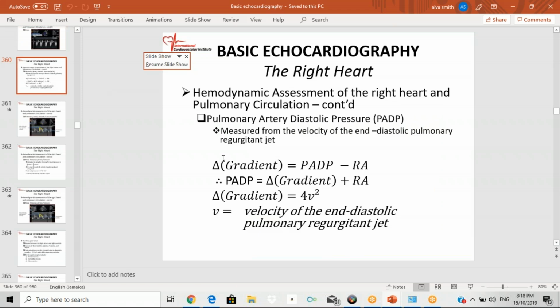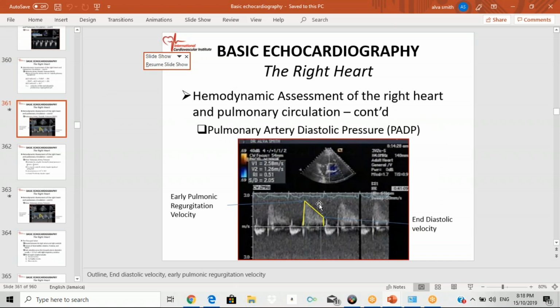We can also get the pulmonary artery diastolic pressure, where you need to have PI, pulmonic insufficiency, okay? So, short axis at the level of the aorta again. The pulmonary trunk is right here. The pulmonary valve, the right ventricular outflow tract is right here. When you get PI, pulmonic insufficiency, pulmonary regurgitation, blood is flowing from the pulmonary trunk across the pulmonic valve into the right ventricular outflow tract.